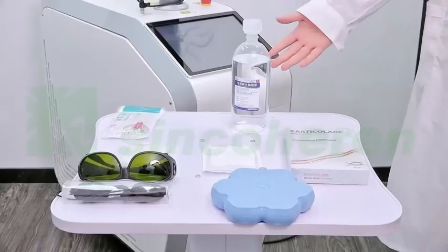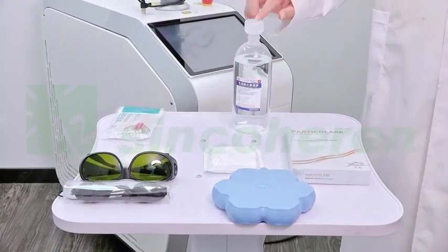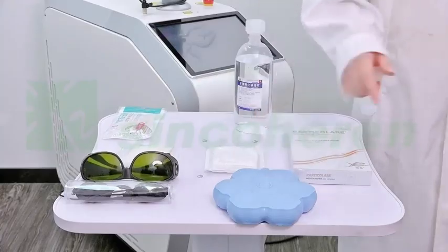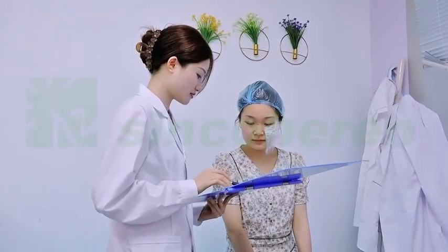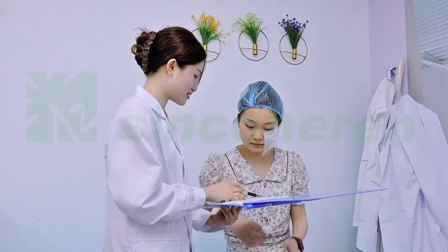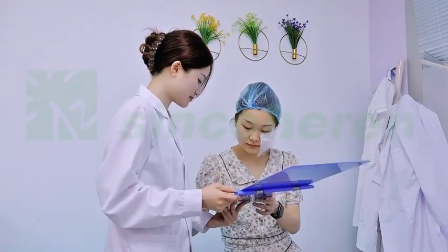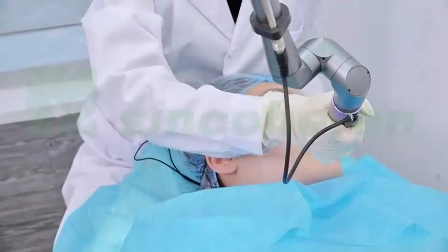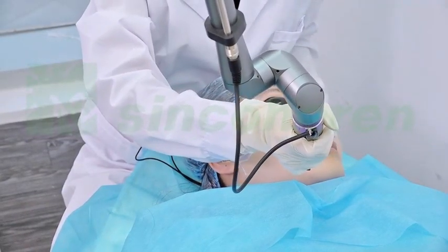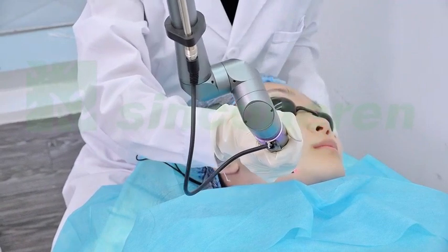Skin rejuvenation. Items preparation: cotton swabs, saline, gloves, gauze, mask, goggle, eyeshade, and ice bag. Patient preparation: be informed of the contraindications. Sign the consent form. Be informed of the post-operative precautions and possible conditions. During the treatment, the patient will feel warm and a slight needling feeling on the face.